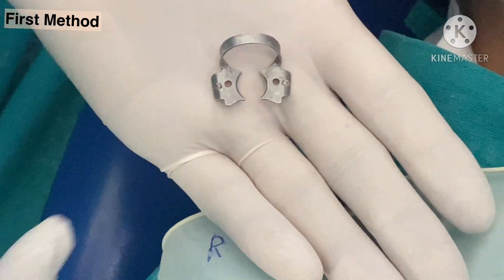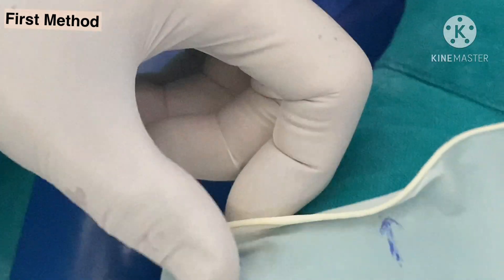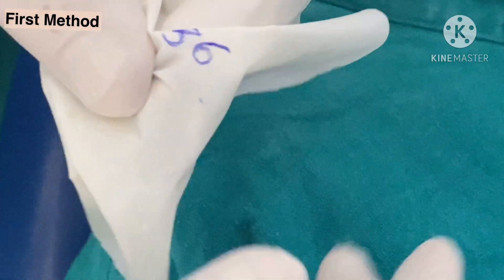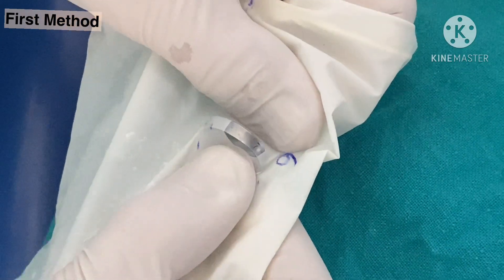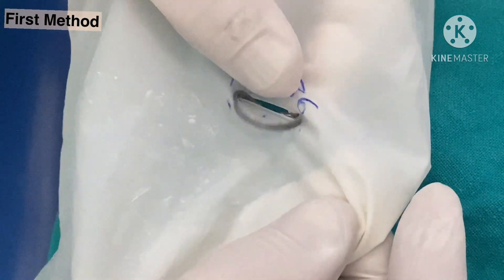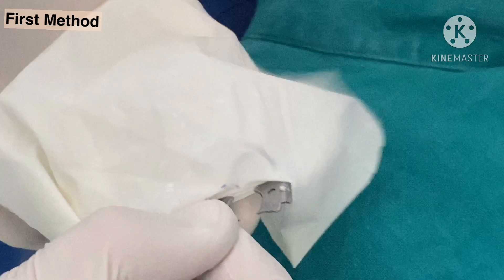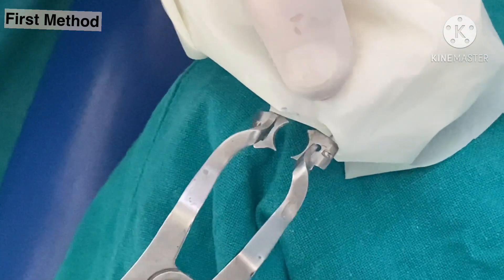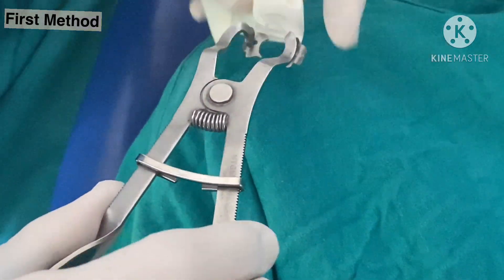For this tooth 3-6, we have chosen clamp number seven. Now this clamp is put underneath the rubber dam — I am going to show you — and positioned towards the hole. Keep the hole in the center of the horizontal bar and hold it firmly with your right hand, then slip it on the horizontal bar. Then invert it. You can see the rubber dam clamp and the two holes — in these two holes we put the prongs of the rubber dam clamp and expand a little. It is ready to be taken into the patient's mouth.